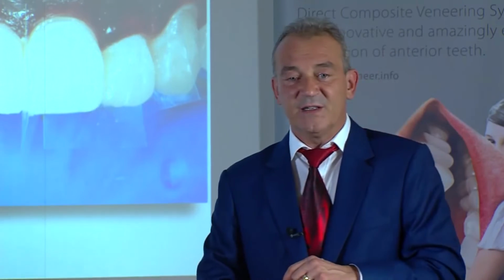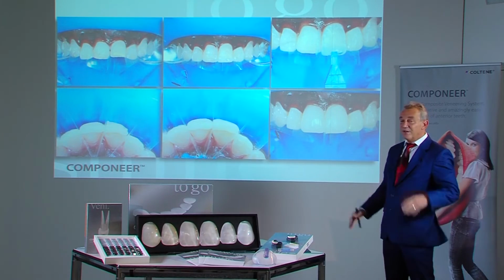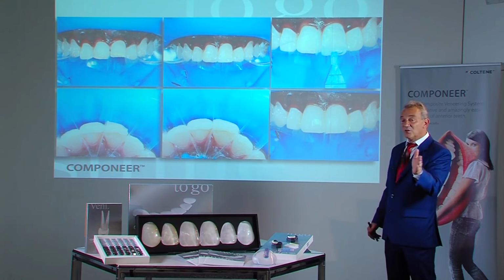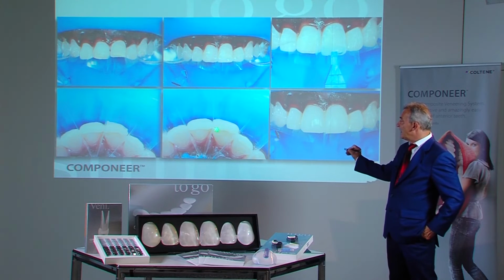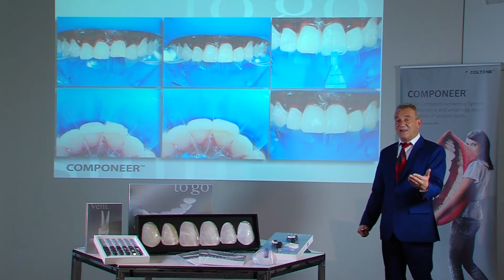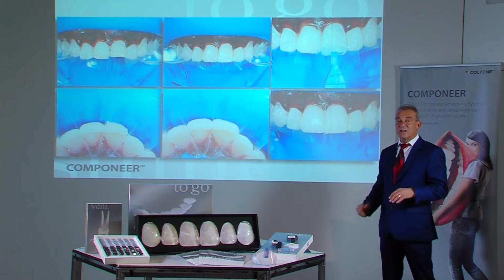This demands incisal control to ensure that the second componeer is also in the correct position at the contact point. In other words, if it is angled, one would need to push in mesial direction with a spatula or placer to position the matrix straight again, so that the componeers are also straight again.